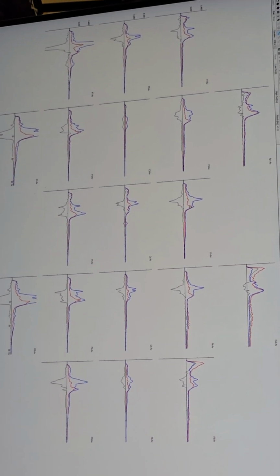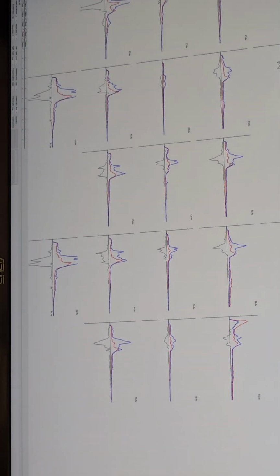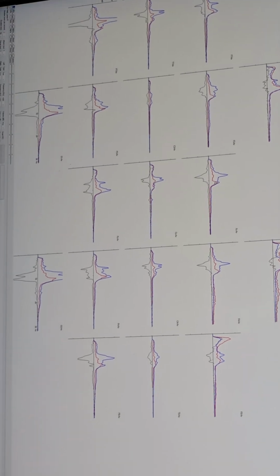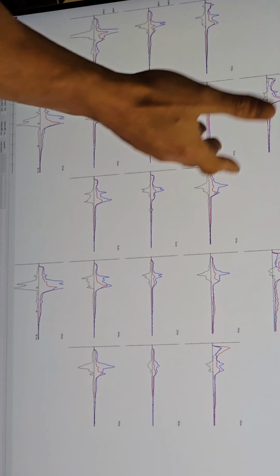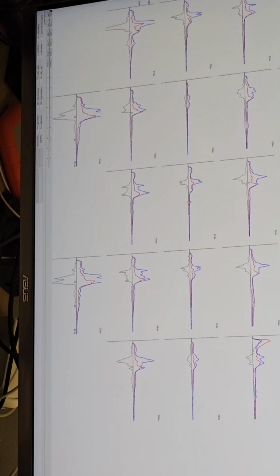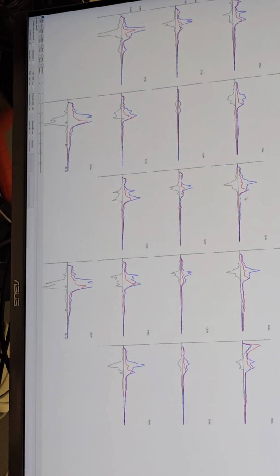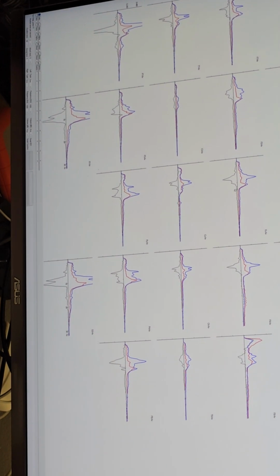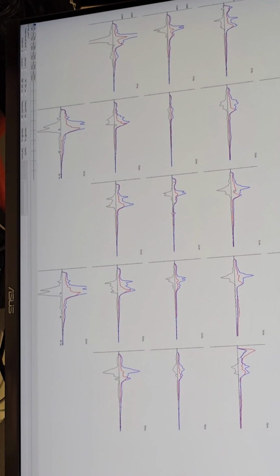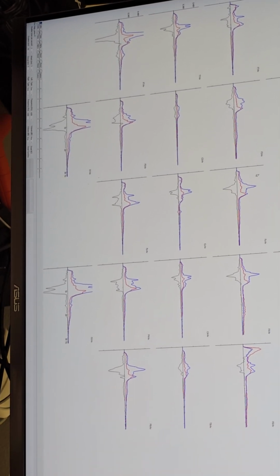So we're left with the stim, or other things. It could be random variation. We'd have to try another session, but remember, I've seen 3 EEGs where you were this low. This is very different. Again, caffeine could be it. We have caffeine to try. It could help, but I wouldn't expect to see this huge a change. I wasn't drowsy because of other factors. So we need to retest in order to really figure it out. But regardless, this is pretty significant.